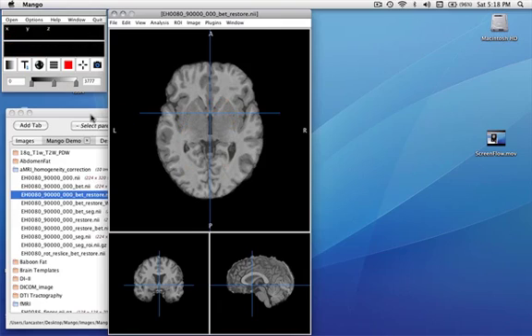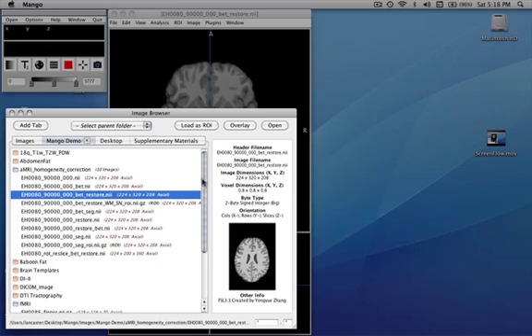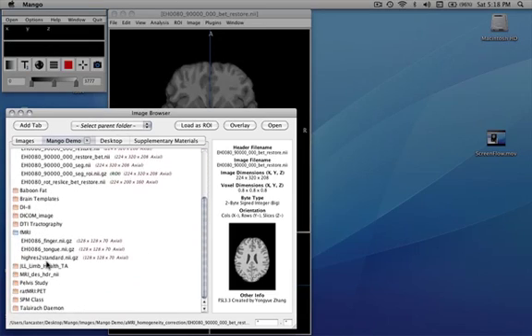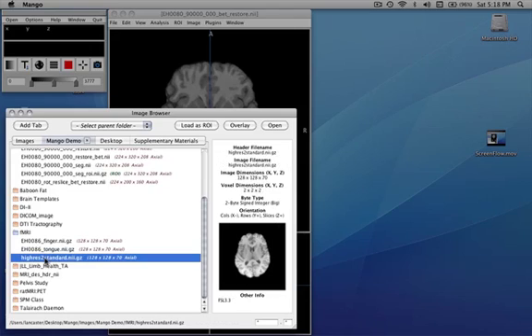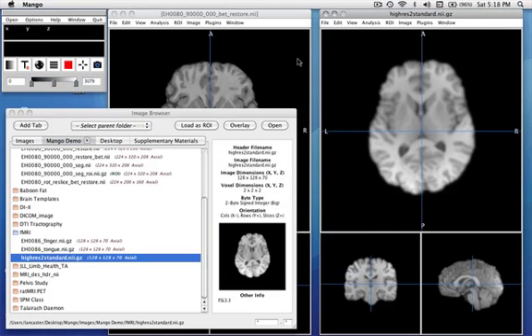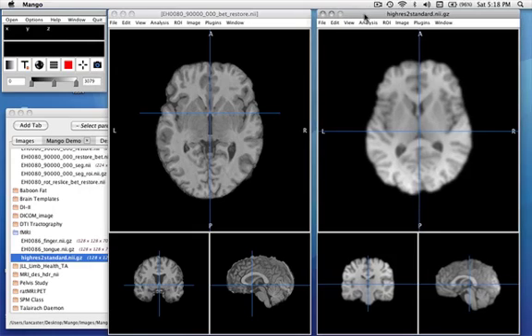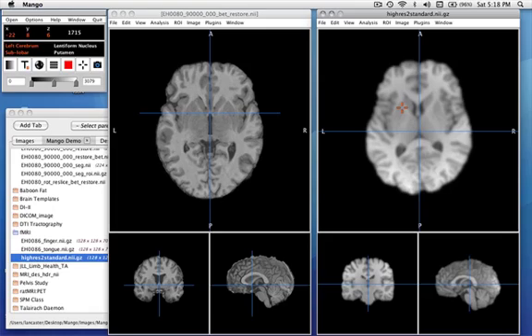So let me open another image that's also been adjusted to Talairach space. This is a low resolution MR image. The image on the left has 0.8 millimeter spacing, the image on the right is a different individual. It was adjusted to 2 millimeter spacings, so that it would be easier to overlay functional MRI and PET data onto.